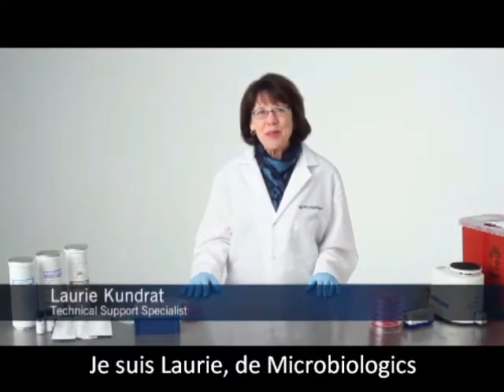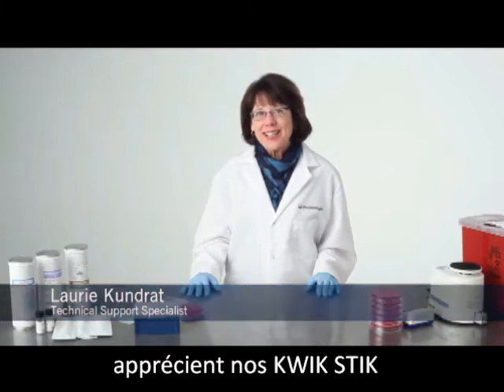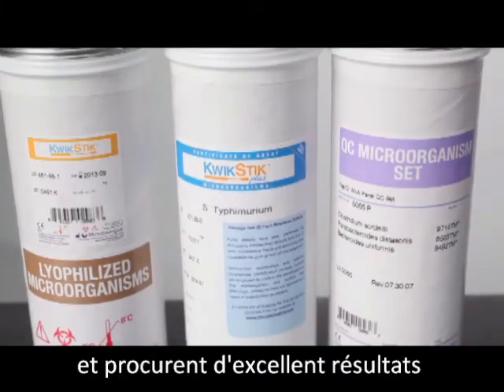Hi, I'm Lori with Microbiologics. Microbiologists around the world love our KWIK STIKs because they are easy to use, affordable, and deliver great results.